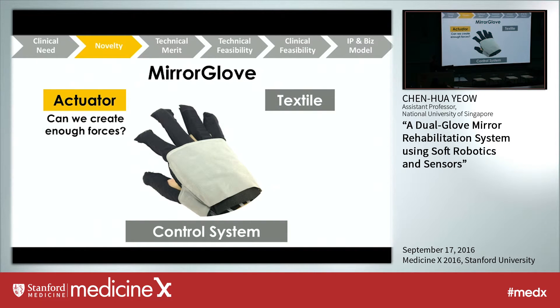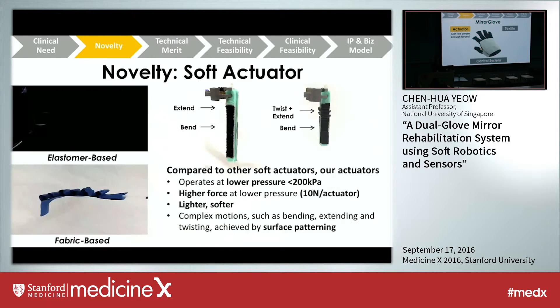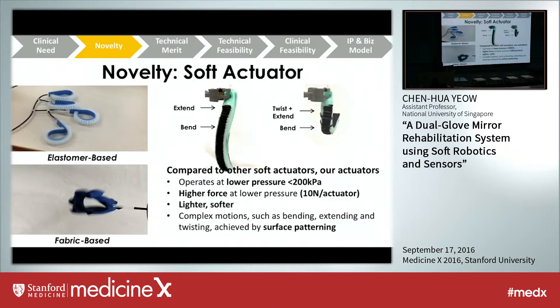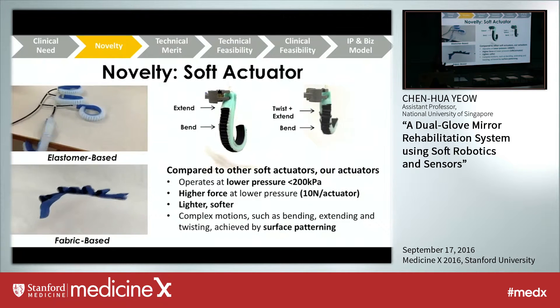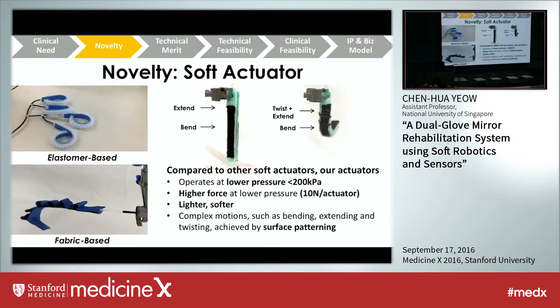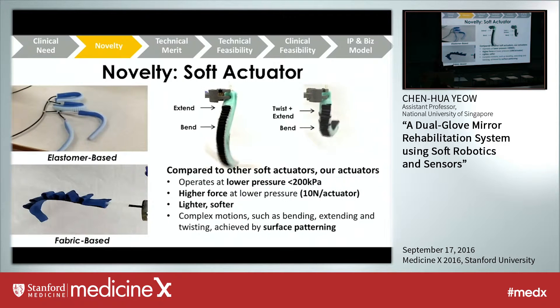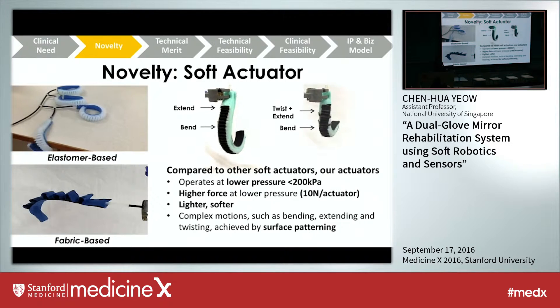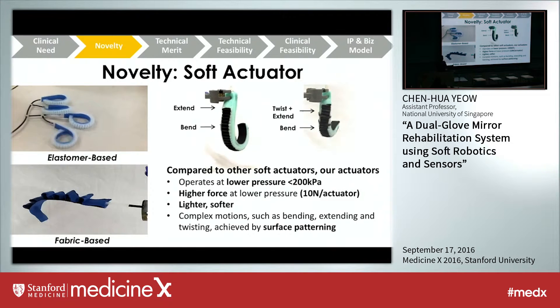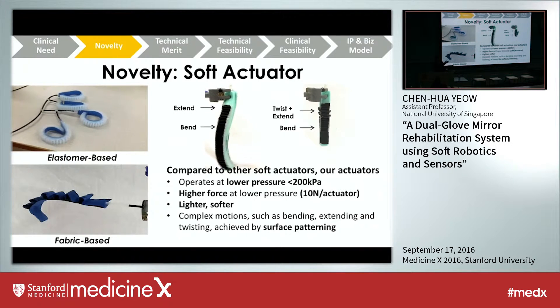I'd like to share three key aspects of our mirror glove design: the actuator, the textile, and the control system. Because our actuators are made of completely soft materials, you might wonder if they can produce enough force. We did quite a bit of research on this. The novelty of our glove is the soft actuator design — as you can see, these are entirely made of soft silicone rubber elastomers. Compared to other soft actuators in the literature, ours operate at lower pressure (less than 200 kPa) and can generate higher force at 10 Newtons of compressive grip force per actuator, and are lighter and softer. By patterning the surface of these actuators, we can create actuators that adopt complex motion such as bending, extending, and twisting.